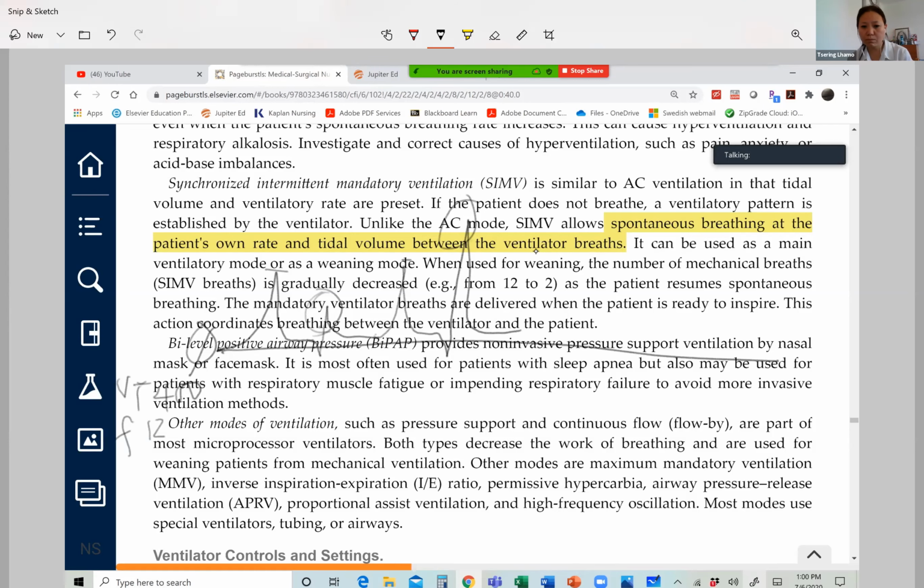So they're not ready to be taken off assist control yet. So the doctor will try either increasing FiO2, or depending on his assessment, let's say the patient goes from respiratory failure to now ARDS, then of course that will delay the patient's progress. They'll have to stay on assist control a little bit longer.